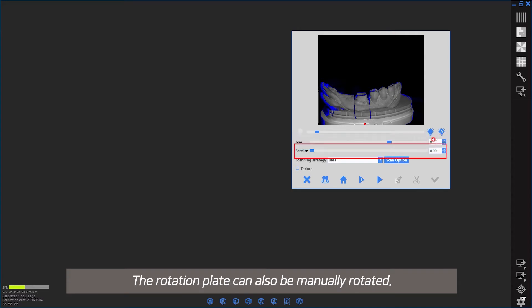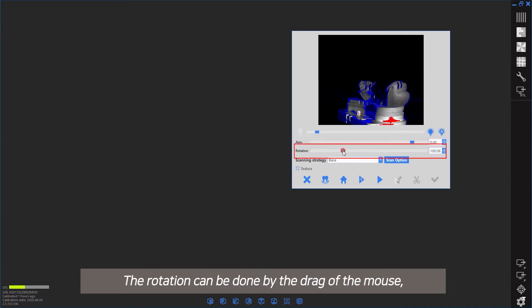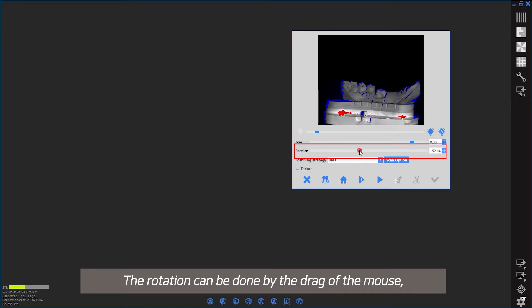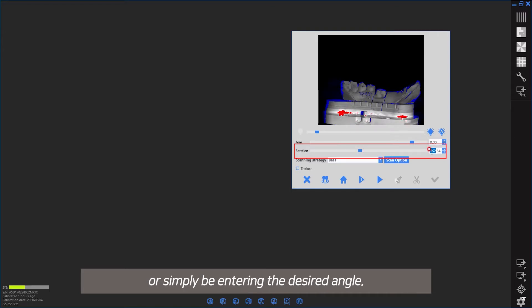The rotation plate can also be manually rotated by dragging the mouse or simply by entering the desired angle.